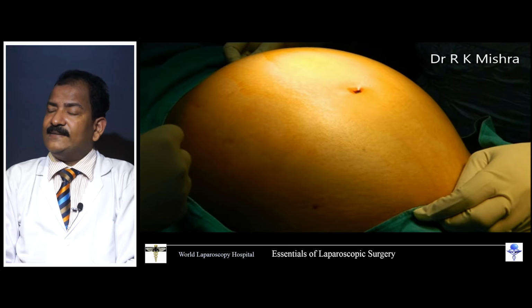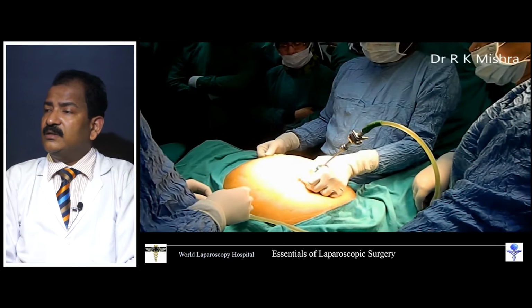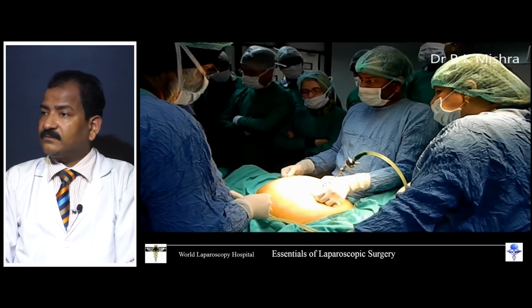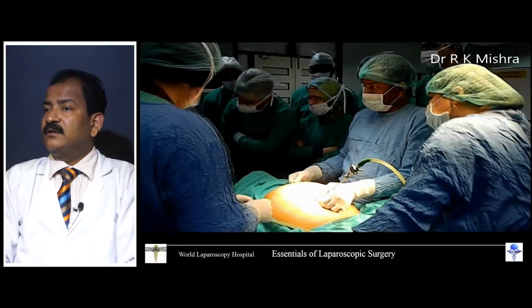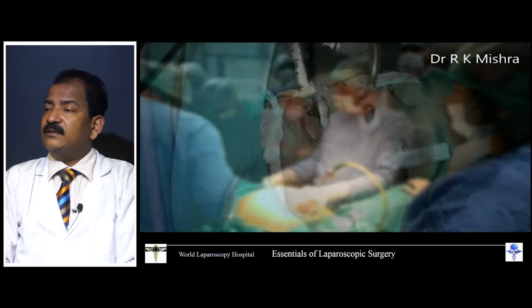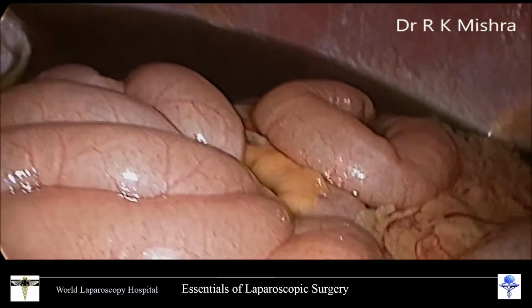So first you will aspirate at the umbilicus. Bowel will rarely be above, because bowel cannot be anterior to the cyst, otherwise the patient would not come walking. This is aspirated. Here 7 liters of fluid came out. The aspiration is done blindly, and then you can aspirate.